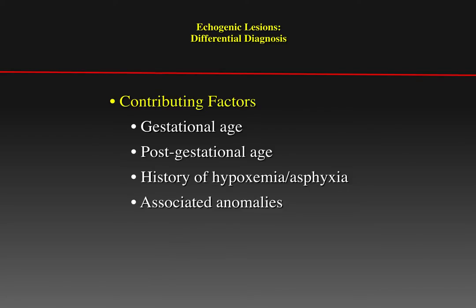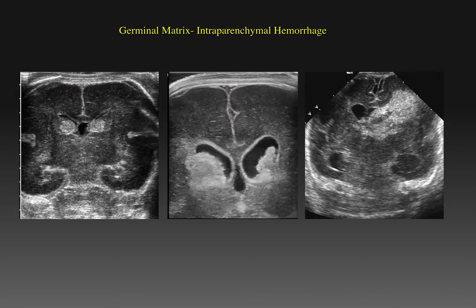one can usually narrow the differential diagnosis somewhat by knowing the gestational age, how old the child is post-gestationally, knowing both the history and type of hypoxemia or asphyxia, and the presence of associated anomalies. These three infants show the typical pattern of premature hemorrhage extending from germinal matrix through intraventricular and intraparenchymal. These hemorrhages are typically brightly echogenic initially and gradually become liquefied and less echogenic over time.